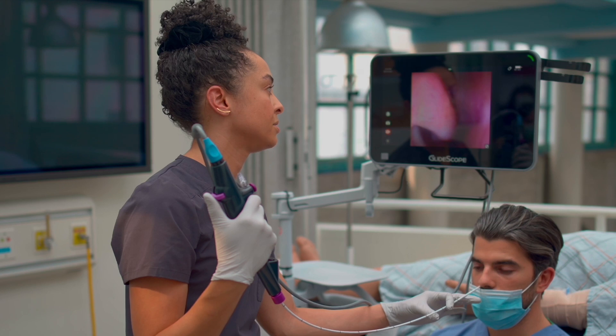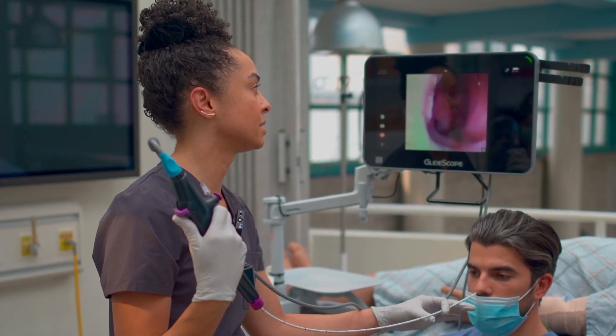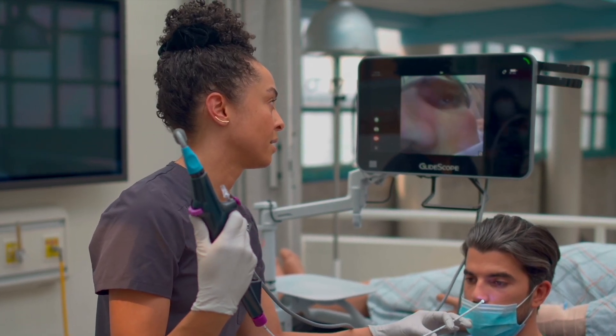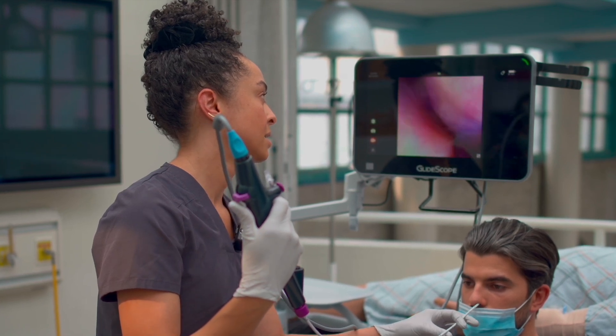On the right of the screen you can see the septum, and a little bit beyond that you see the middle turbinate. Seeing the middle turbinate is a pretty good landmark because that lets you know that there aren't any major obstructions between you and there.